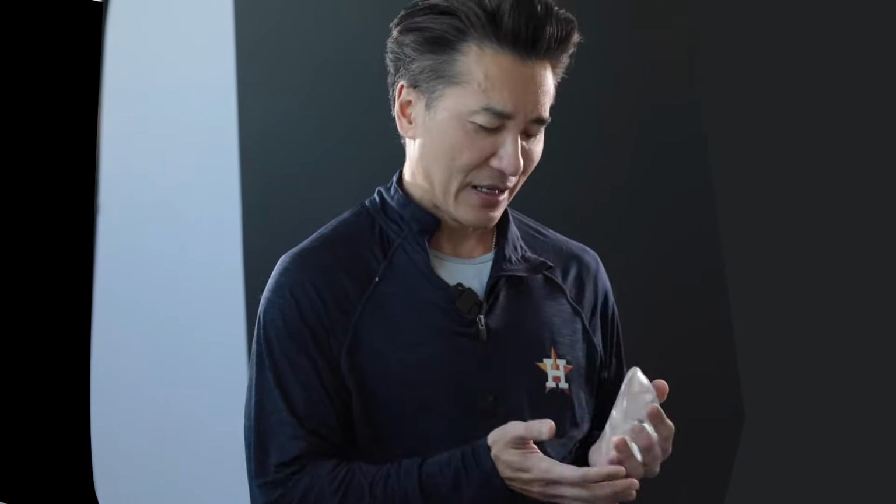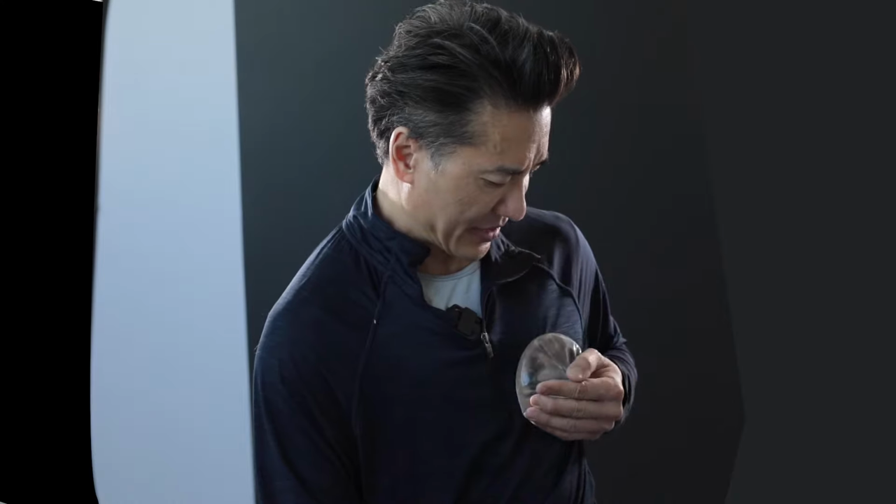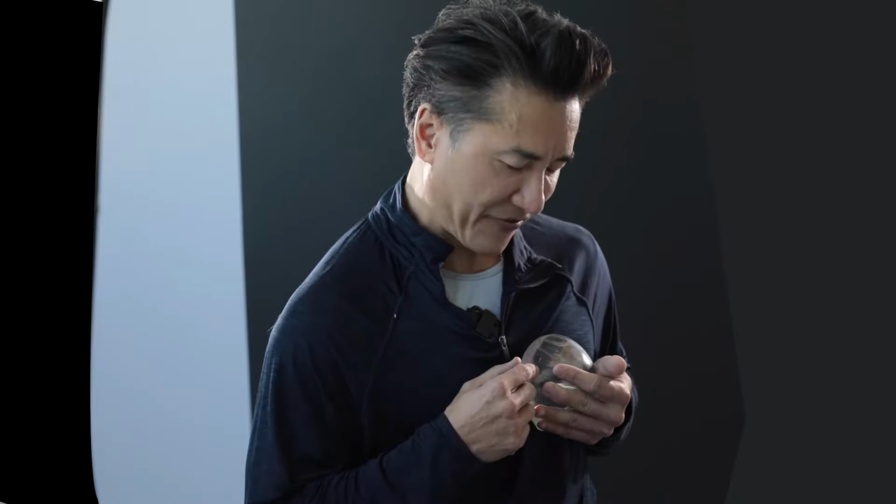And also, rippling is noticeable when the pocket is not correctly made. For example, if the pocket is too small for the implant, it may just squish the implant and make it sit incorrectly, so that way you can really feel and see the rippling, okay? And so are there treatments for rippling?